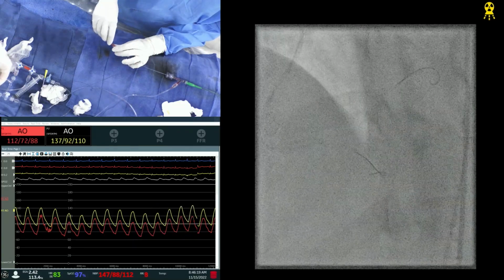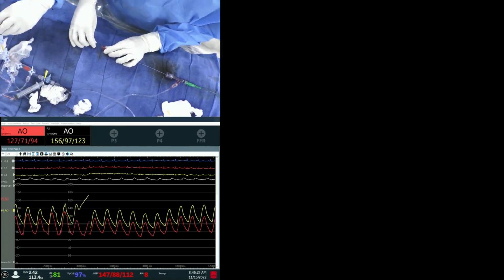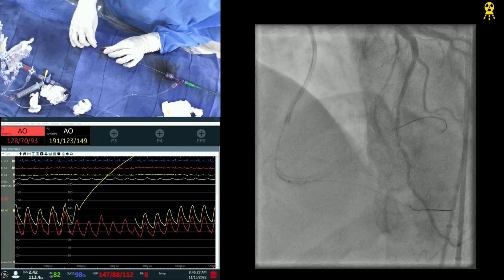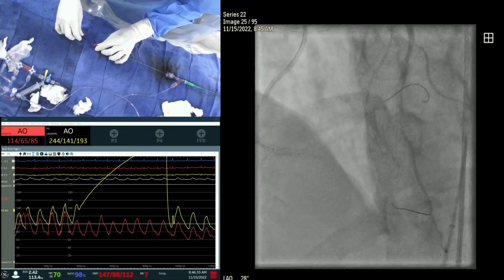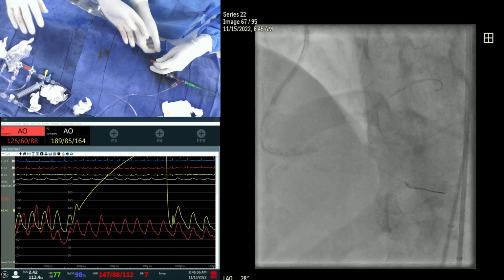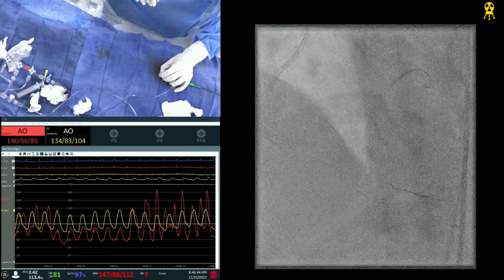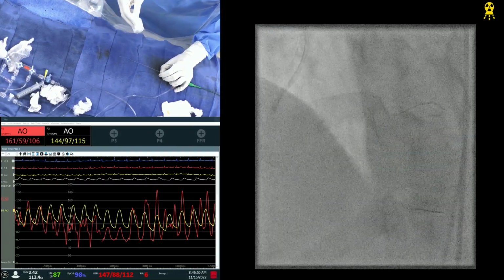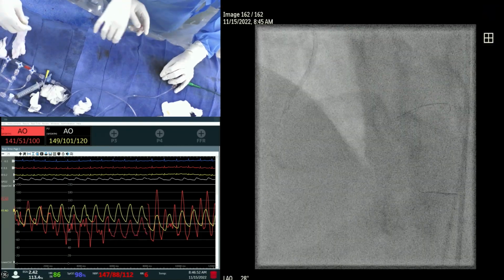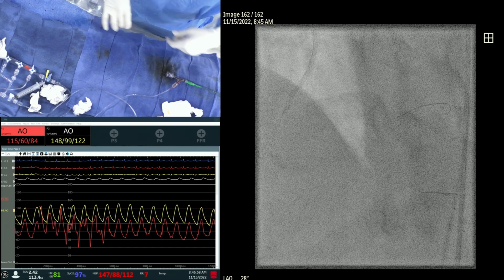Okay. No, we may be okay now. Good, good, good. Now hold on. Okay, let's take a picture. Yeah, we are good. Yeah, a 2.0 balloon. Yeah, let's go to 2.0 now. Good. Okay, so we have retrieved our PDA. Can you ask Yulia to come down? Yeah.